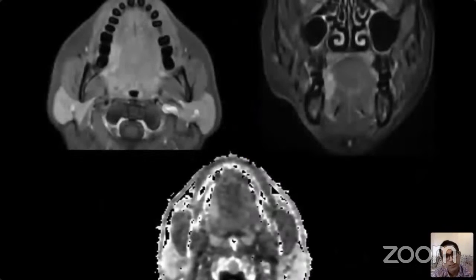I'll show some case capsules as to how we can plan the management, and I'll discuss the points on how to read this particular case. So there is case number 1, and in this particular case, I will start reporting my tongue tumor: there's a right lateral border tongue disease, which is enhancing and shows a hyperintense signal on the T2 weighted images. I'll measure the depth of invasion, and I'll document the depth of invasion in this particular case. So that's approximately 7 millimeters, which will make it a T2 tumor.